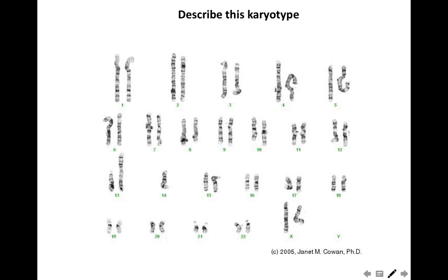You don't count this as two chromosomes, even though it carries the genetic material of two chromosomes, but because it's a single body, it is counted as one. So the total number of chromosomes is 45, XX, and this is the structurally abnormal chromosome, which is called Robertsonian translocation between 13 and 14.